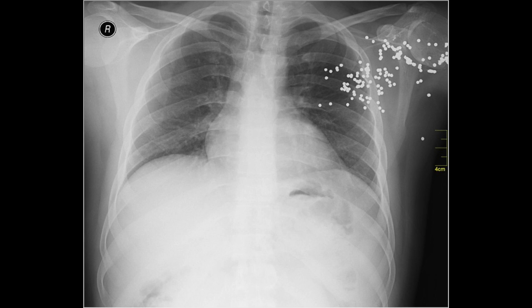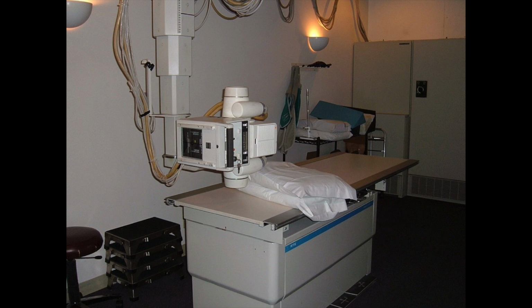They do create good images of bones, or any other dense object in the body. So they're used to detect osteoporosis, fractures, or foreign objects lodged in the body. The picture shown here depicts a shotgun wound. So here's an X-ray machine over this table that the patient would lie on. And the film would be slipped under the table somewhere here.